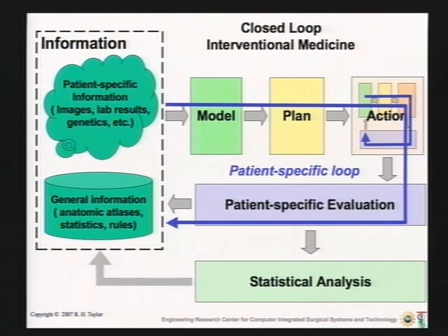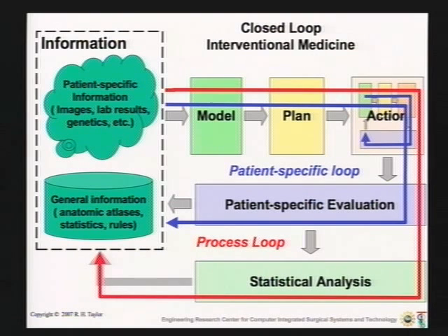The other thing, again, when in IBM manufacturing, one of the things that was most interesting to me is we kept the data records. And over time, as we begin to do this, we generate a lot more data, and we should be able to use that, combine it with outcomes information to do what amounts to statistical process control. And so this is, I think, a major part of the future that we've just now begun to enable.